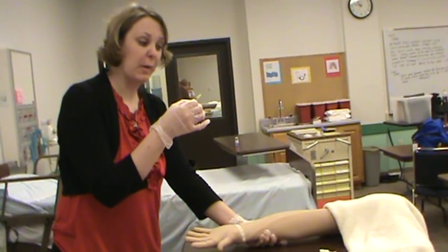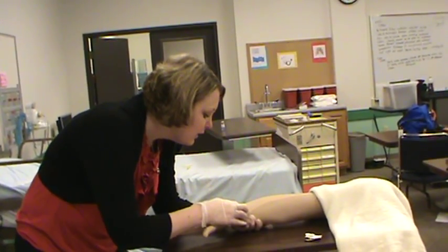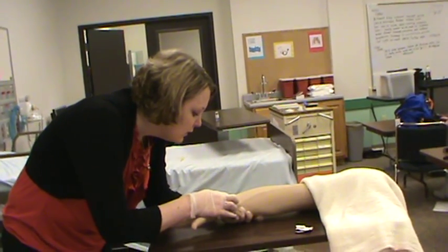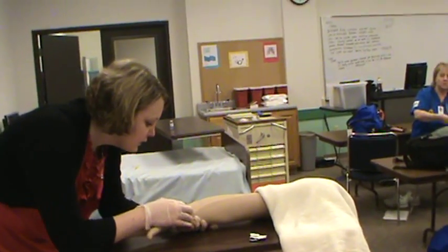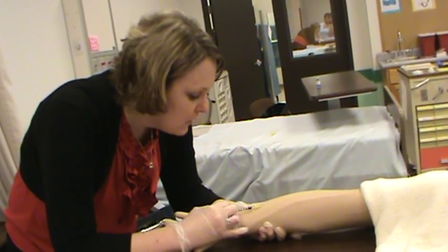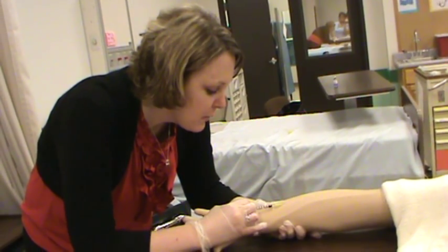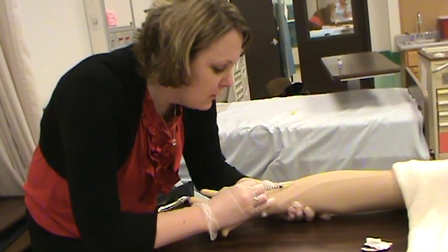So I'm looking for the bevel of the needle. I have the bevel up, and I'm going to go in almost flat with the skin, at a very low angle. Insert the needle only about 1/8 inch. So I insert it just about that much. Slowly and gently inject the saline while watching for a small bleb to appear. Now in this IV arm, you won't actually see the bleb appear, but you'll go ahead and just simulate that you would push it in.